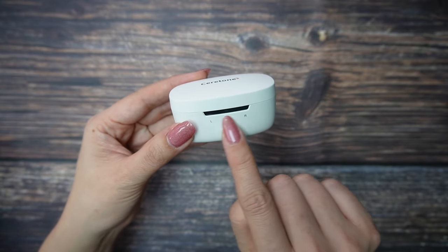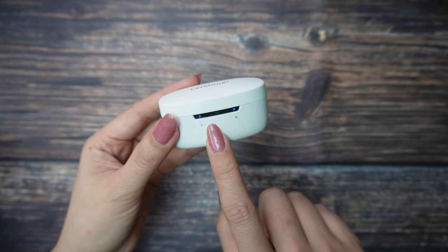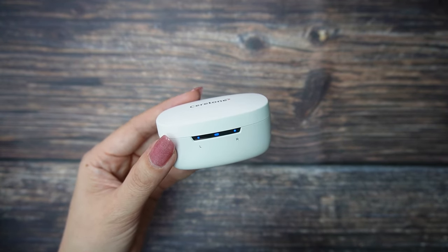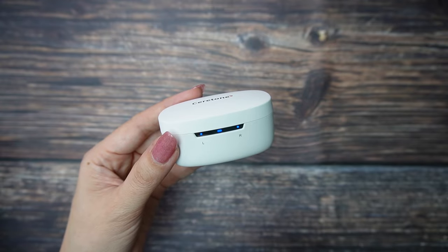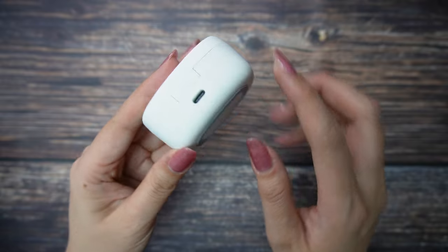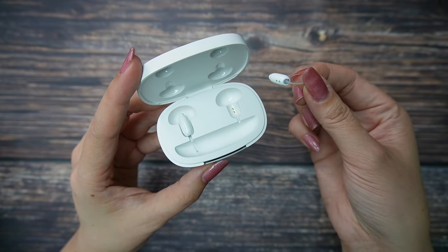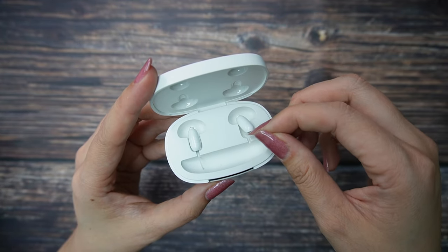The charging box has light indicators on the front. The hearing aids are charging now so you can see the indication — right now the light is blue, but when fully charged it will turn white. There is a rubber on the bottom and a USB port on the back. When you charge your hearing aids, you need to make sure the connectors are pointing down.